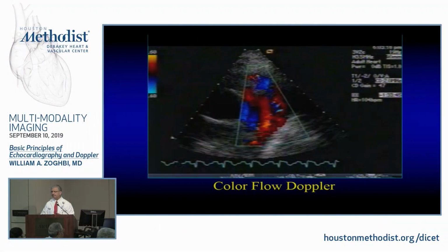What's color Doppler? Color Doppler is actually pulse Doppler, right? It's pulse Doppler, but it's a crude pulse Doppler because I have so much to process. I cannot use fast Fourier transform, which tells me accurately what the velocity is. I have to have just a crude estimate of what the average velocity is of the result. So tell me first direction, one way or another. Is it coming towards me or going away?